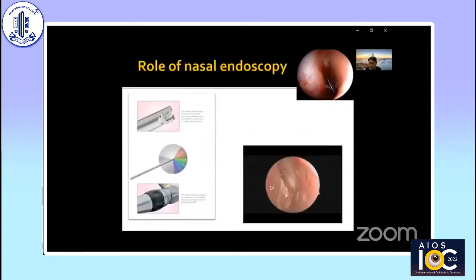So typically, the optimal timing is at around age 1. Nasal endoscopy is very helpful, at least in my own view, in the management of congenital NLDO. It allows you to have a direct visualization of the nasal cavity. Nasal pathology can be picked up and also managed accordingly. Even if the patient is not having nasal pathology, if you are doing the syringing and probing or other intervention, this will allow you to ensure proper location and proper placement of the equipment. Say, for example, if you're doing the probe, if you can see the probe over the inferior meatus at the normal opening, you know that you are not having a false track. So direct visualization over the nasal cavity during this procedure is very helpful.